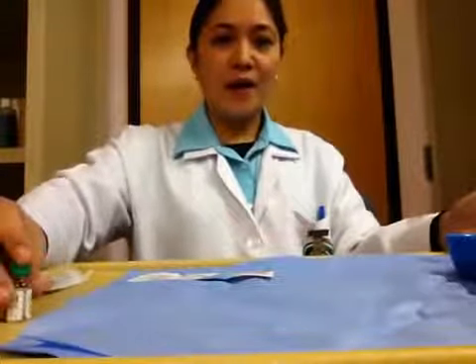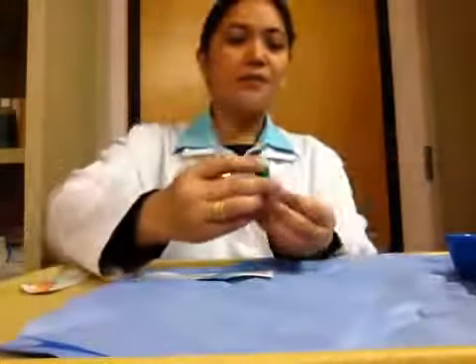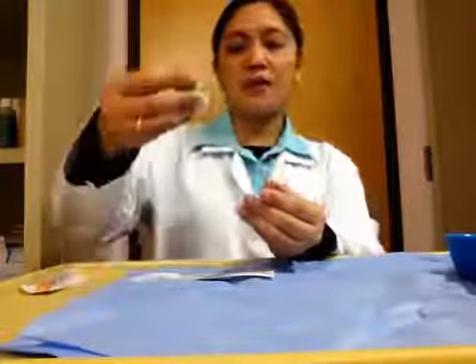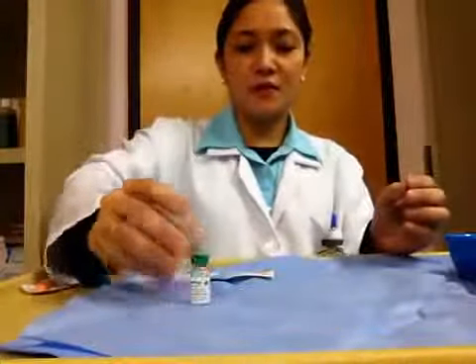I'm going to prepare medication to be given subcutaneously. The most common medication that is given subcutaneously is insulin. So we have to prepare our insulin, read the label to check whether it is the insulin that you need, check the expiration date, and check the cloudiness of the medication, so it's still okay.